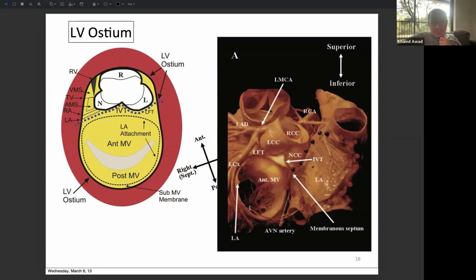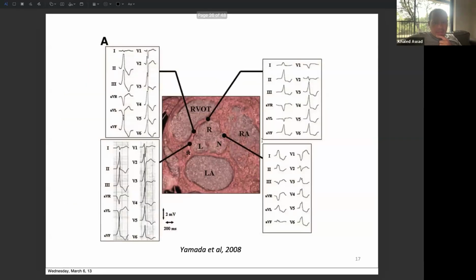When you are on the mitral annulus, obviously you're right behind the circumflex. You get the LAD between the RVOT and the anterior wall of the left ventricle. And when you are in the left cusp, you are right under the bifurcation of the left main. Okay, you got to respect all of these structures. You have to look with intracardiac echo or use contrast or something to know where you're at. You can see the distance between the bottom of the left cusp and where the left main is. It's not a lot. It's about 1.5 centimeters or 2 centimeters, maybe at max. You got to be aware of where you're at so you don't cause too much trouble.